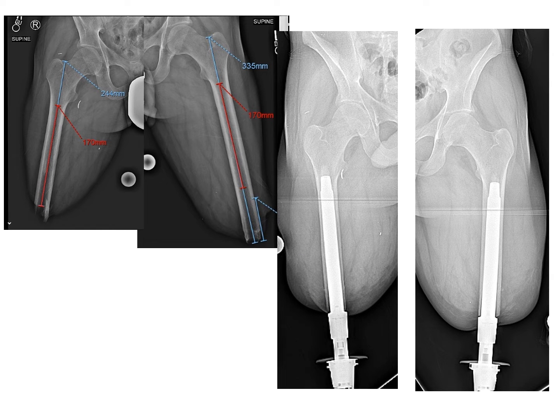Osseointegration limb replacement is the insertion of a titanium implant into the residual bone, which creates a direct skeletal connection with the prosthetic leg.